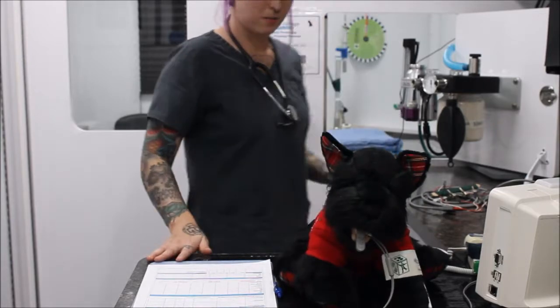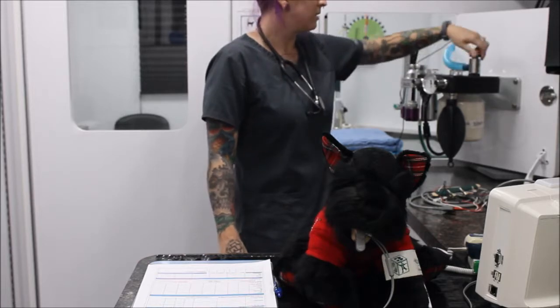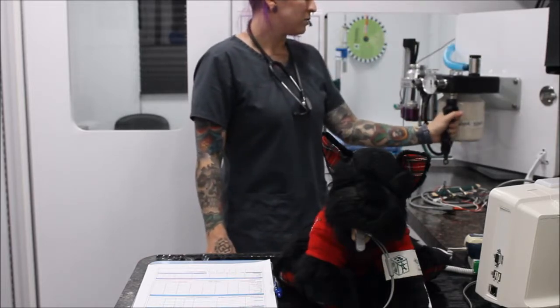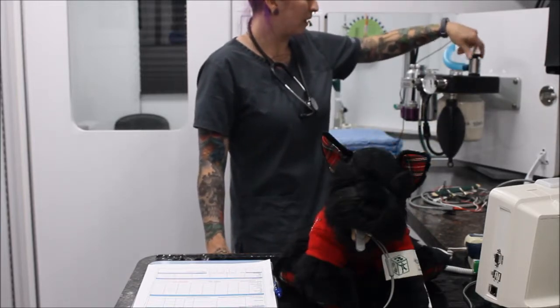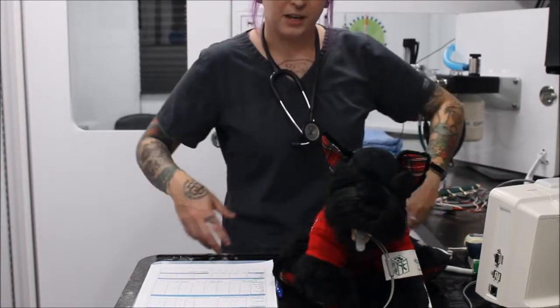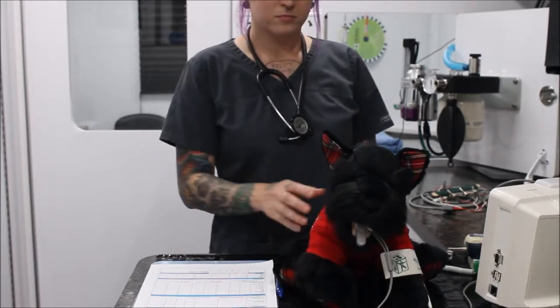Another thing about monitoring respiratory rhythm is you want to make sure you manually vent or manually breathe for your patient: closing the pop-off valve, squeezing the bag to about 15 to 20 centimeters of water, and then opening the pop-off valve. That can help our patient significantly during anesthesia, just to help open up the lungs as they start to decrease.